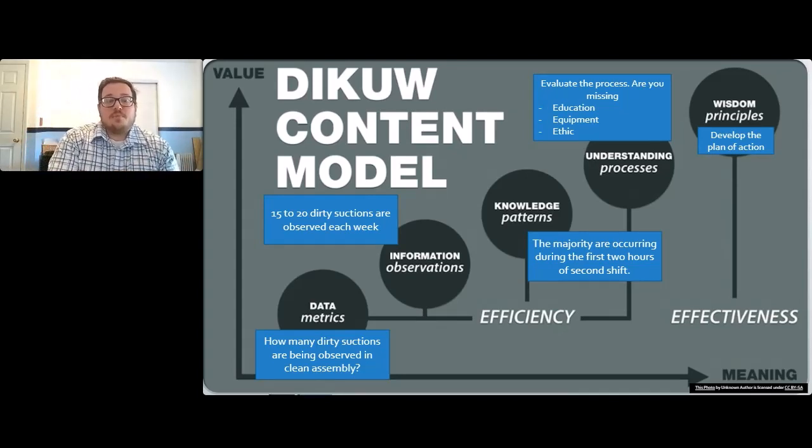Then we can have an equipment breakdown. One of our process improvement projects was around the brushes and the lumen size. And so we go back there and we had a lot of ENT kits that use a 3 French lumen, so pretty small, narrow lumen. Well, we go back there and we ask the technician, where do you keep the brushes for your 3 French suctions? Oh, all of a sudden we're looking everywhere. We're looking under floor mats and in the bathroom and down in lab, and no, just kidding. But there was no brush sufficient for a 3 French suction in decontam. So that's an equipment failure.